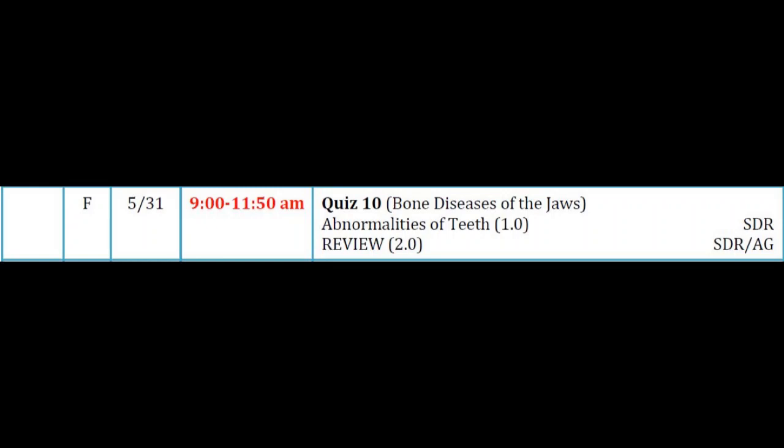So you've seen them. So what do we see in this patient? 1, 2, 3, 4 molars. 1, 2, 3 molars. 1, 2, 3, 4 molars. So 3 quadrants have a 4th molar. What do we see in this patient? Extra bicuspids. So extra bicuspids are another fairly common place to have a supernumerary tooth.